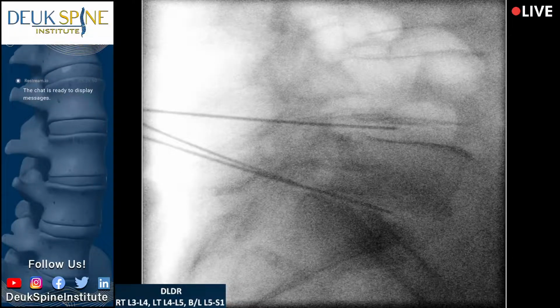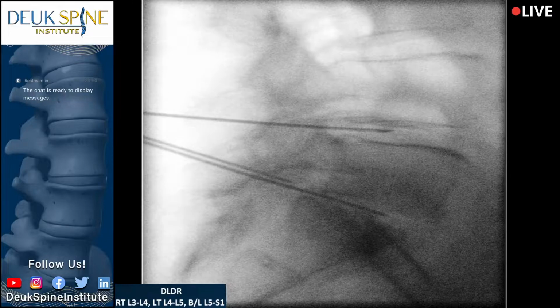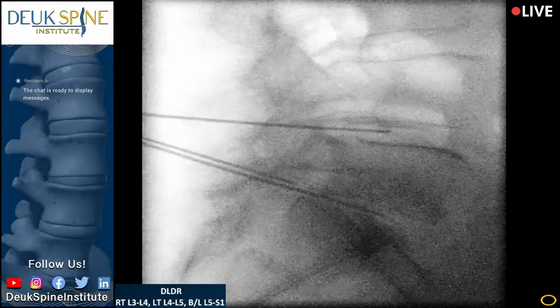So I want to access L5-S1 through both sides. Where do you feel that? I can't hear her. Where'd you say? Right there. In your back. Right there, yeah. Yeah, I'm sorry about that. We're almost done. Where is that? Right there. All right, you're doing great. Shot and then AP.